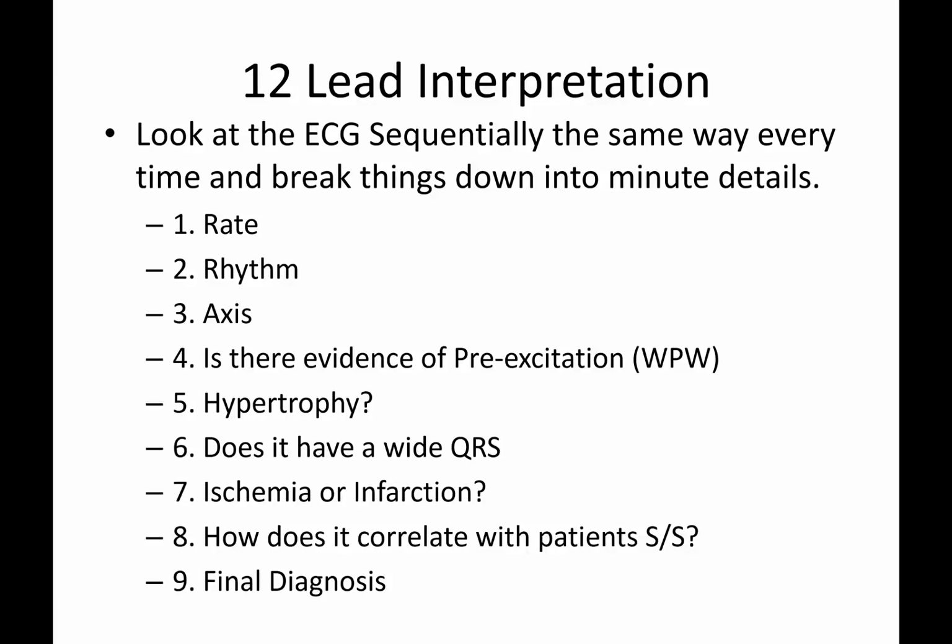All right, here we go, picking back up where we left off. This in front of us is the overall plan for the remainder of the lecture, which is the whole reason why we're here in the first place, learning how to interpret 12 leads. We're going to walk through rate, we're going to walk through rhythm. The section that we're doing now is going to have a lot of focus on axis.